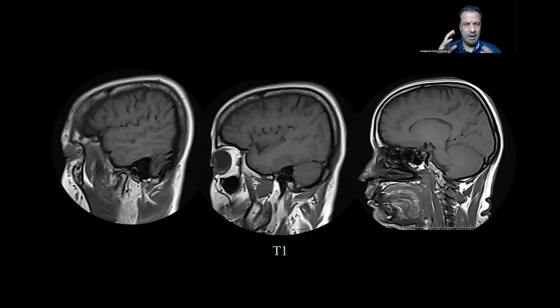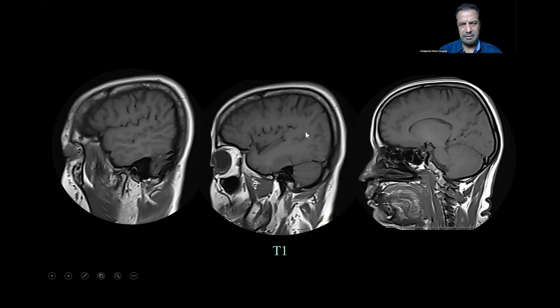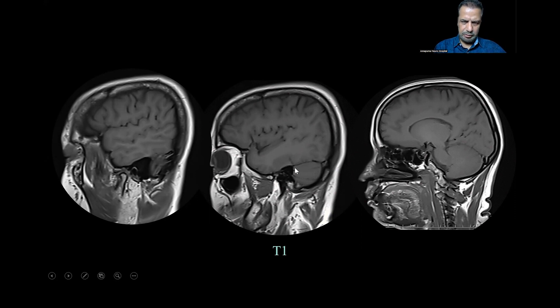Now on the sagittal image, you have to imagine the axial image and try to reconstruct the same thing on sagittal. This is from lateral to medial. As you go in, you can see the Sylvian fissure, the temporal lobe, the superior, middle, and inferior temporal gyri, and a little bit of the cerebellum. The petrosal bone is visible, the frontal lobe, and the parietal lobe. As you go a little bit more medial, the Sylvian fissure has split, the insular cortex is seen, and the tentorium is being attached to the transverse sinus and into the petrous bone, with the cerebellum there.